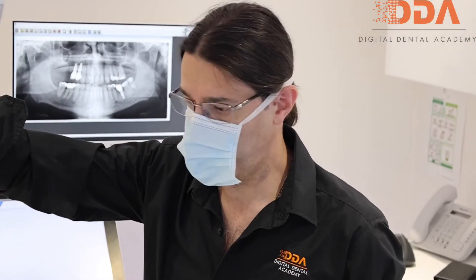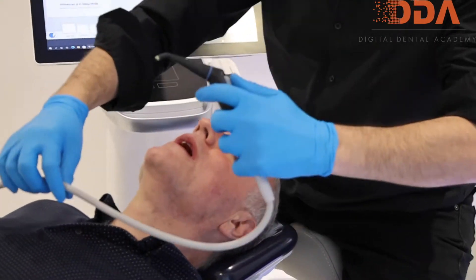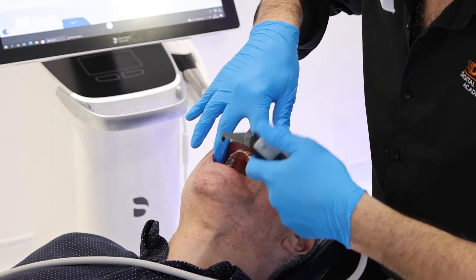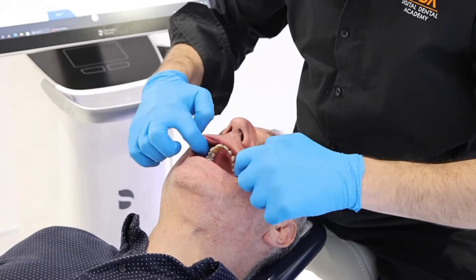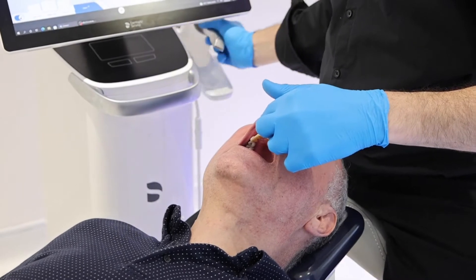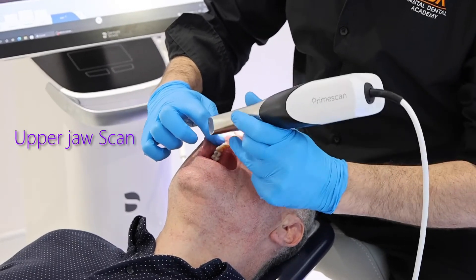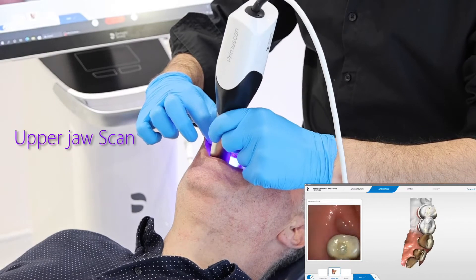We're going to scan the upper jaw and the lower jaw. We always start off keeping the teeth as dry as possible. I'm left-handed working in a right-handed surgery today, but we have good retraction and a good dry field. It's also important when scanning that we manage to scan the soft tissue as well around the teeth, not just the teeth themselves.